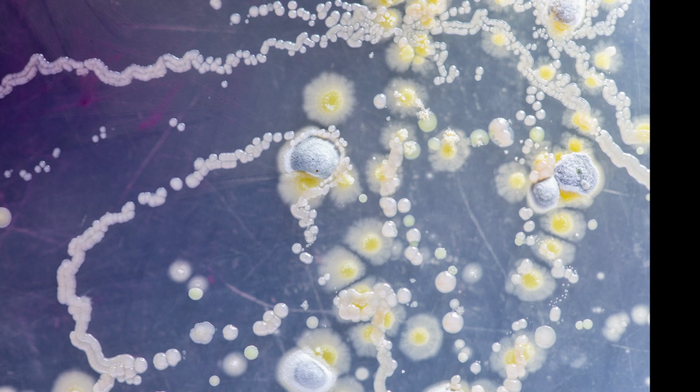Here is isolate number 5, where you can see that some people have actually read definitely smaller zonages than what we did. We had 16 to 17 millimeters, and maybe that's because of the colonies here, which might appear more. Those plates were left in room temperature during the day, so maybe those colonies weren't that clear in the morning. But everyone read a zone diameter that was 12 millimeters or more, so that's above the susceptible breakpoint. And then we have to investigate the zonage.